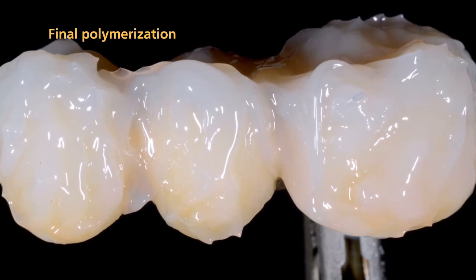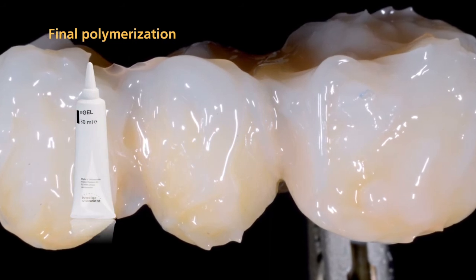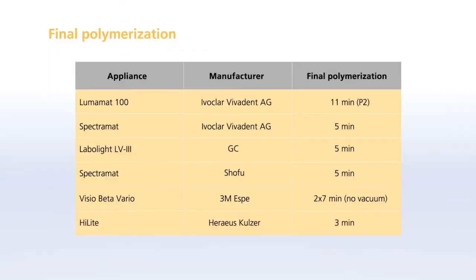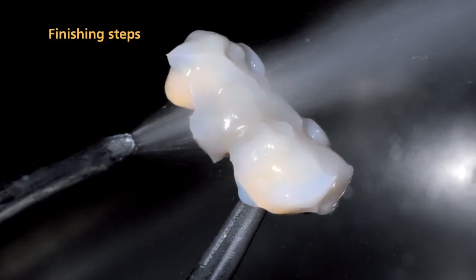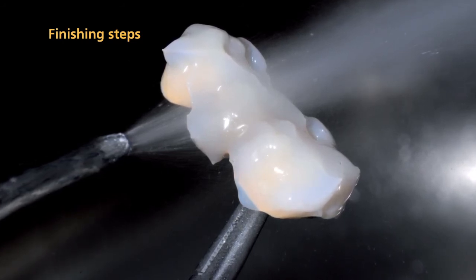After the layering procedure has been completed, all areas must be pre-cured. Before you conduct the final polymerization step in the Lumamat light furnace, apply SR-Gel to the NEXCO surface. Make sure that all areas are covered and the layer is not too thick. Please observe the polymerization parameters specified in the SR-NEXCO instructions for use. After you have completed the polymerization procedure, completely remove SR-Gel from the restoration using running water or a steamer.